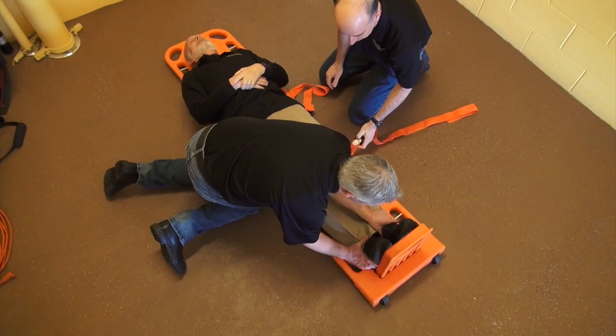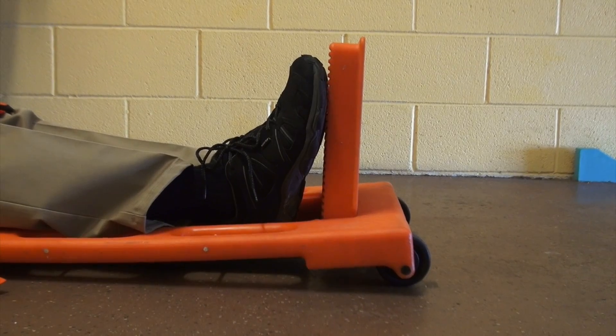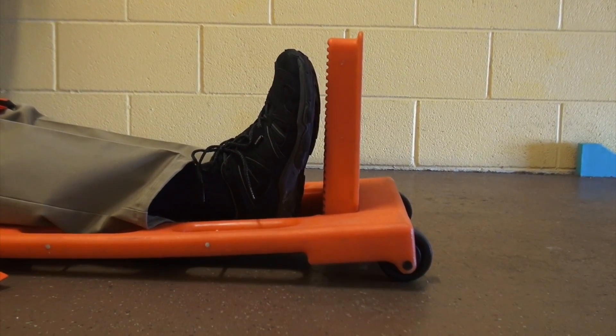Make sure there is no gap between the patient's heels and the footrest. If there is a gap, the patient will slide during transport.